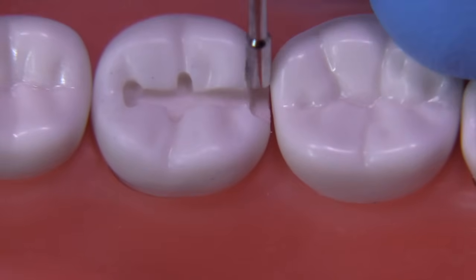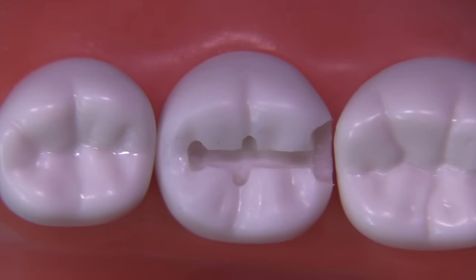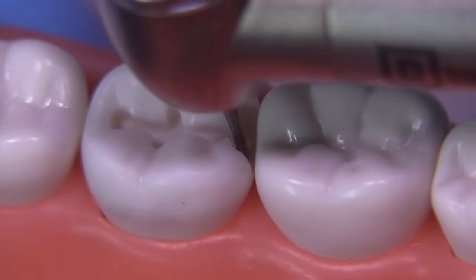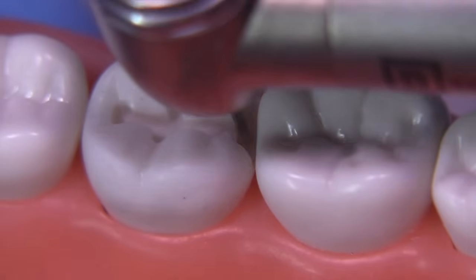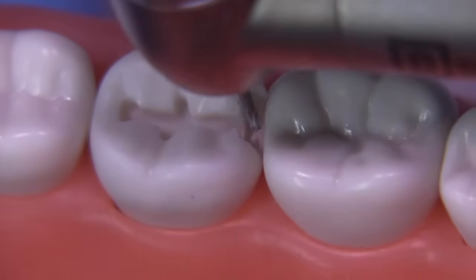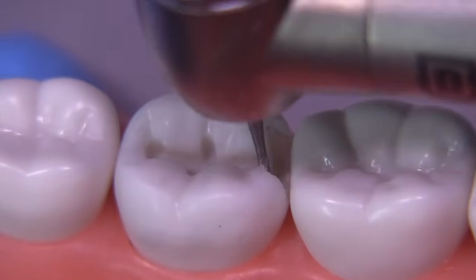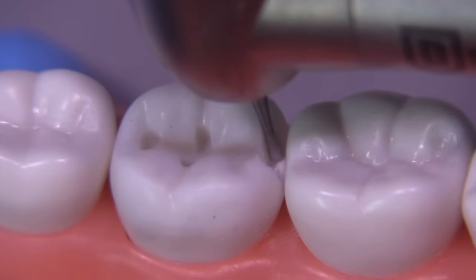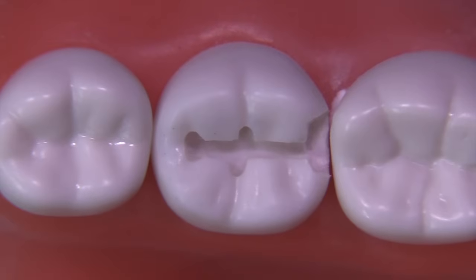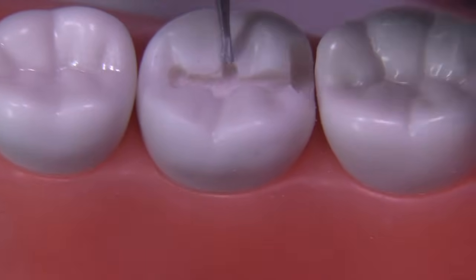The RGS 4 measures 1.5 millimeters, and you can see that this does not fit. So we know we're under-extended axially and need to move the burr more axially — more towards the center of the tooth — to get the proper axial depth. The proper terminology is axial depth, not gingival wall width. Now I'm using the 330 RGS burr, which is terrific for making all of the internal line angles more defined — not sharp, but more defined. It also has a very flat end, unlike the regular 330, so it can create really nice flat walls. It measures two millimeters in length.